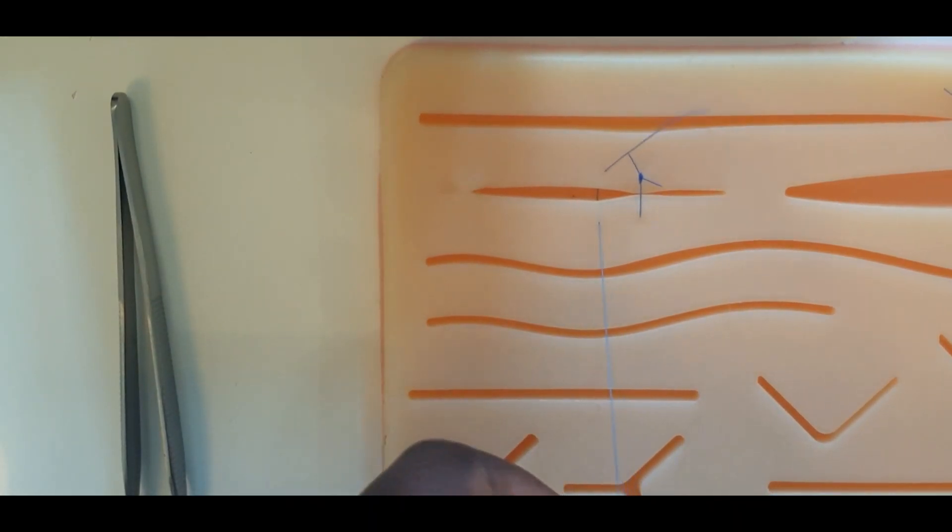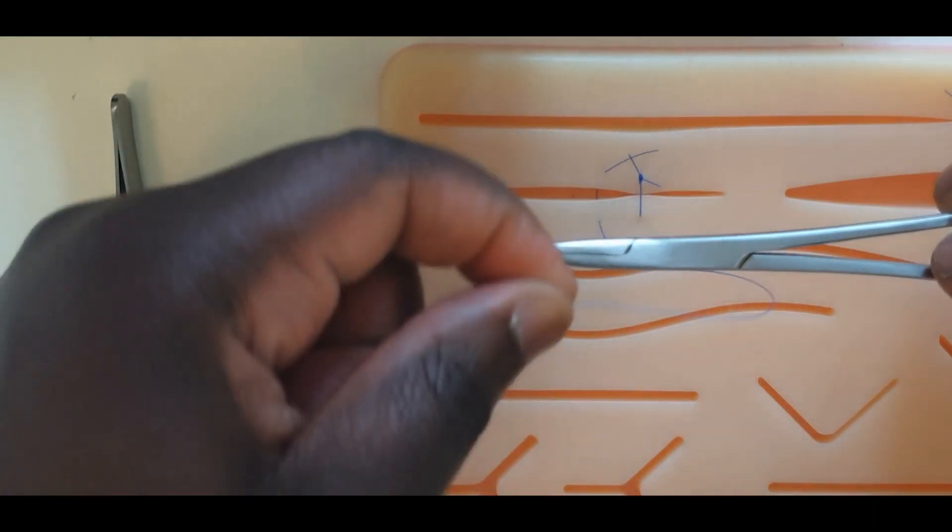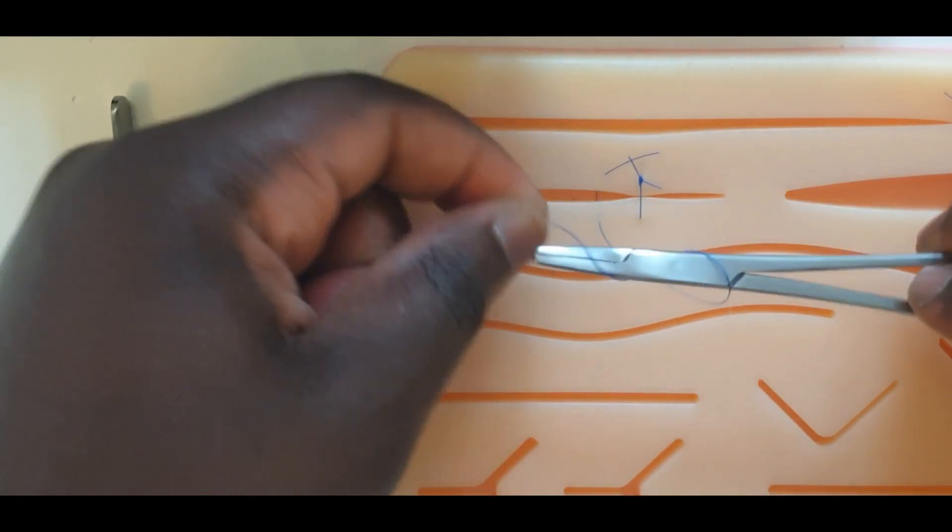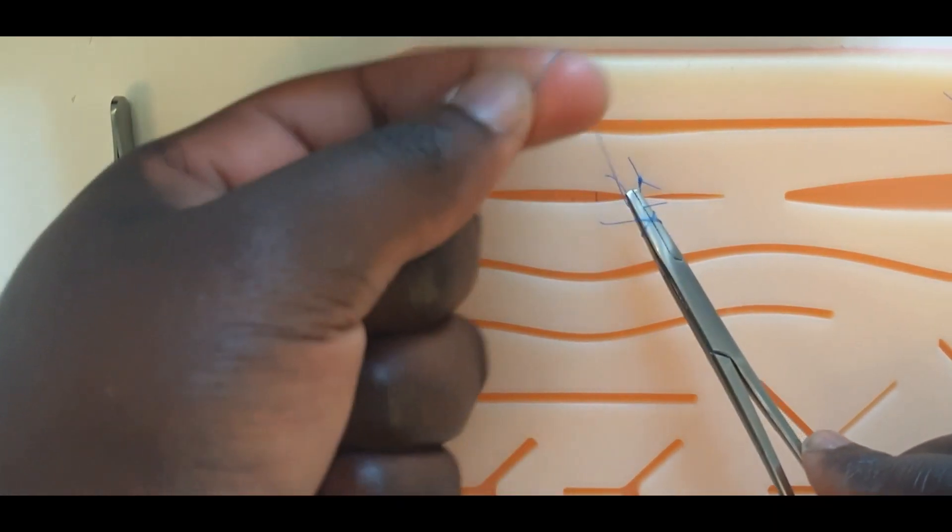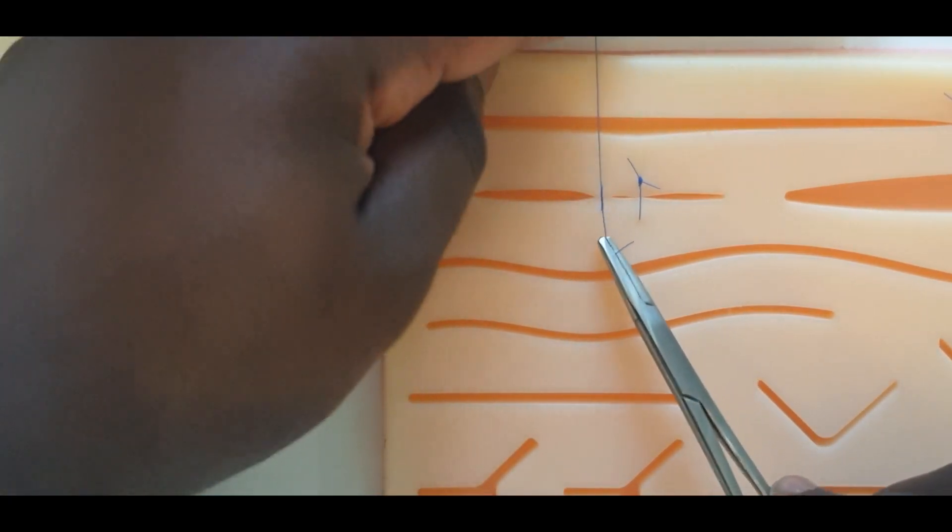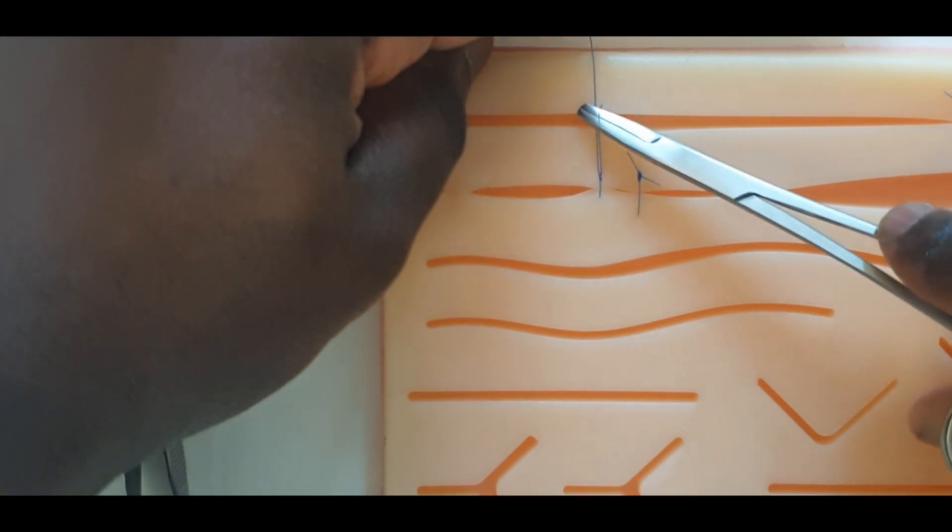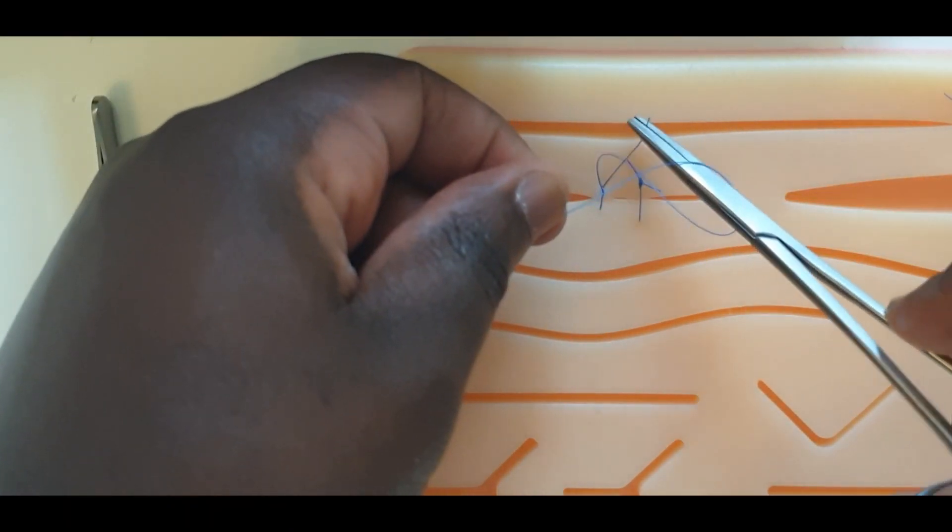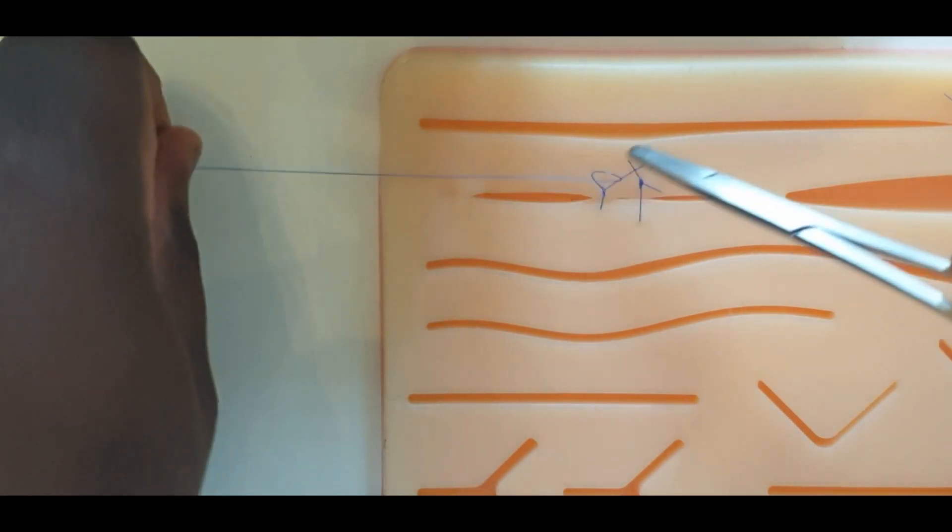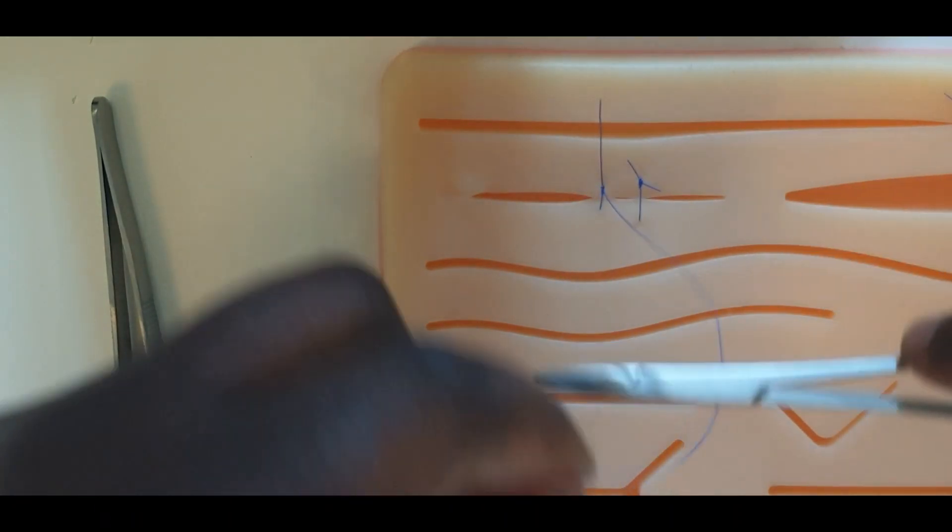A surgeon's knot is made. Tension is maintained on the long thread. The short thread is advanced towards the long thread. Further wreath knots are laid to produce secure square knots.